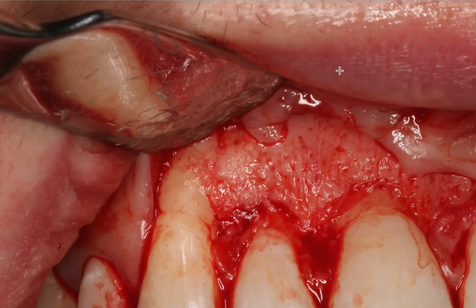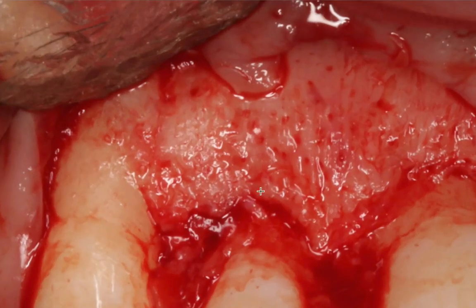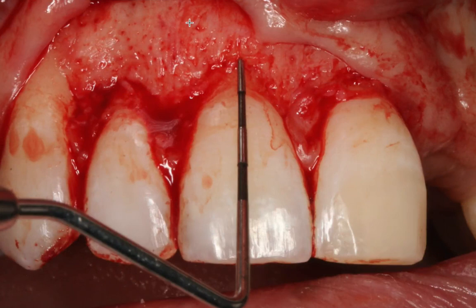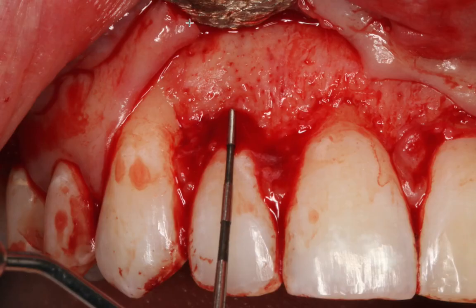So this is very interesting to see. The bone level around the canine is actually proper. Here's the CEJ. We have about between 2 and 3 millimeters of bone height. We have proper bone thickness, and that tells me that around this tooth, nothing needs to be changed. Here's the measurement between the CEJ and the bone level, and same thing for the lateral incisor.